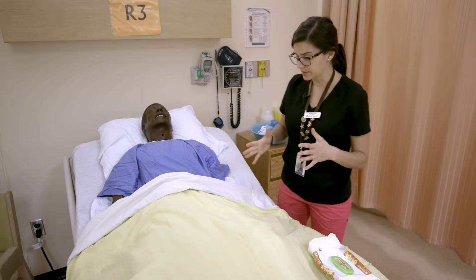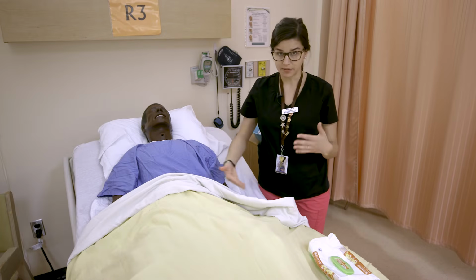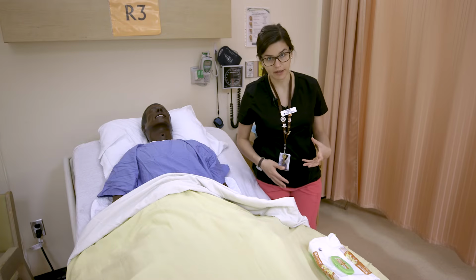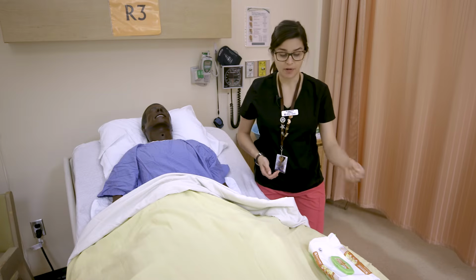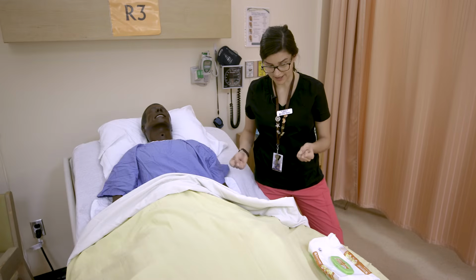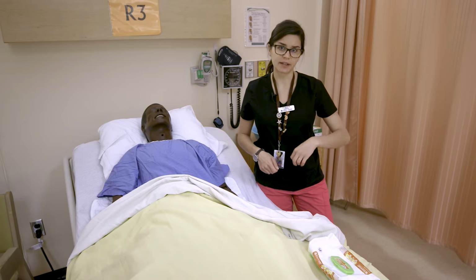So a couple other principles with the catheter, we want to make sure that we keep the drainage bag below the level of their bladder, and we also want to make sure that it's attached to a non-movable part of the bed. So for example, you don't want to have it on the side rails because if somebody releases the side rail or drops it down, it could pull on the person and be quite painful or actually detach, which would leave you with an open system, which is also not good. So you want to put it on a spot of the bed that's not going to move.